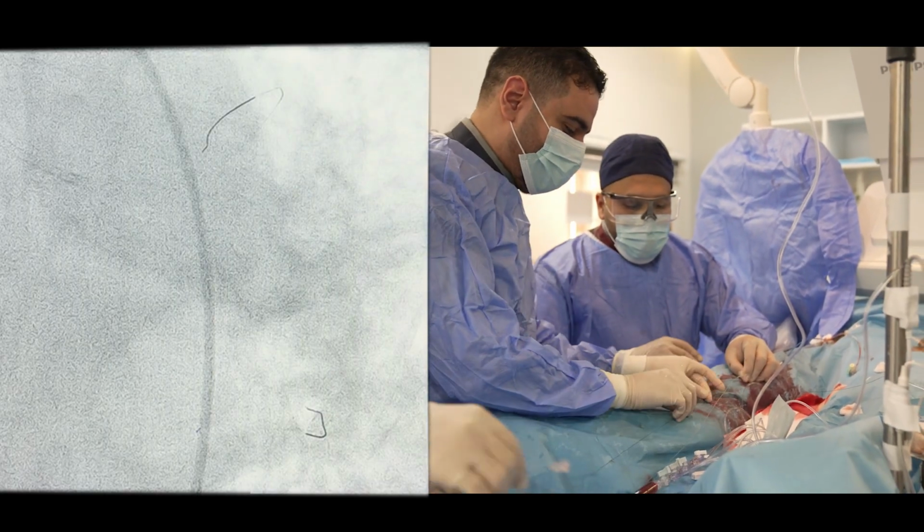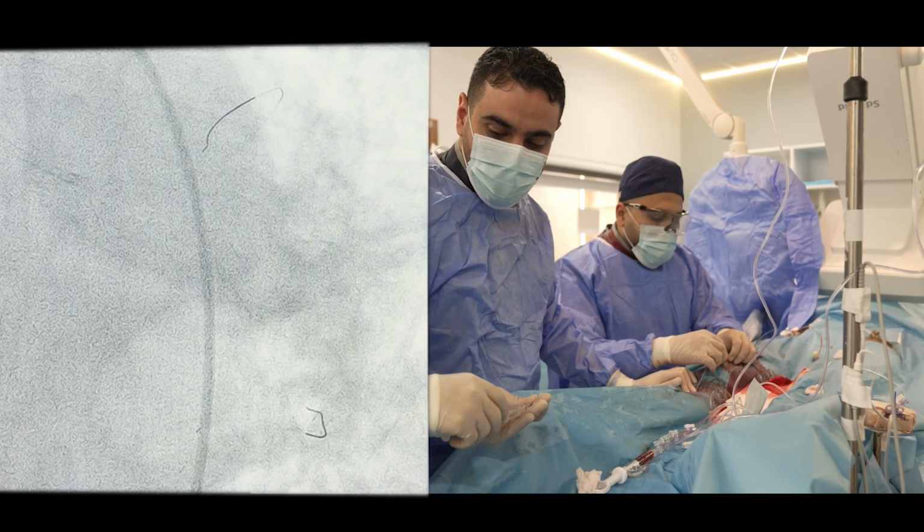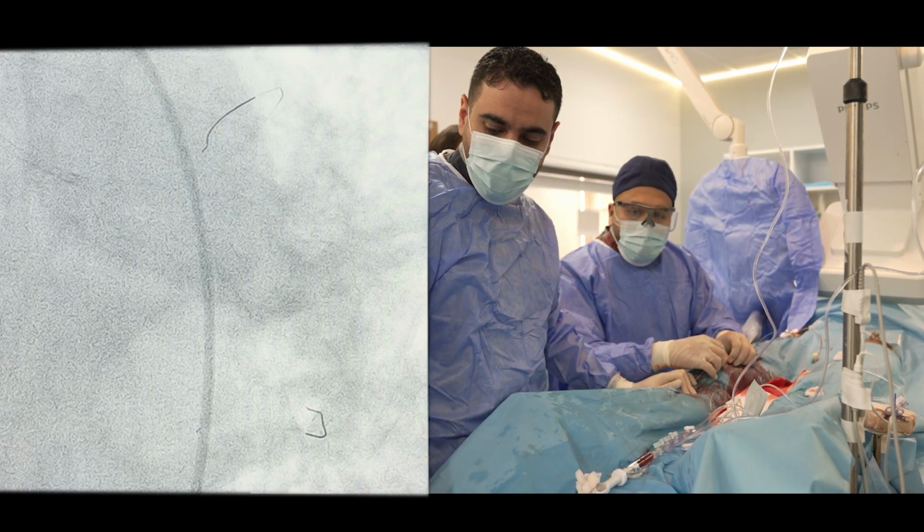So the pressure now is 130. It came down to around 70 when we inflated the left main stem.